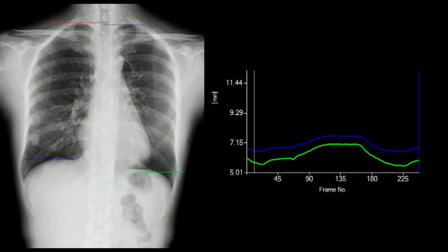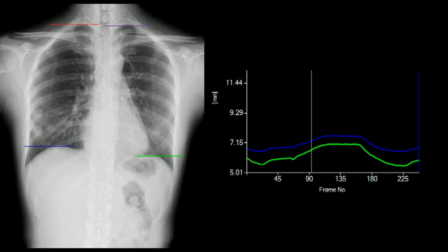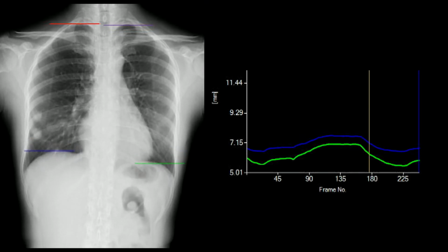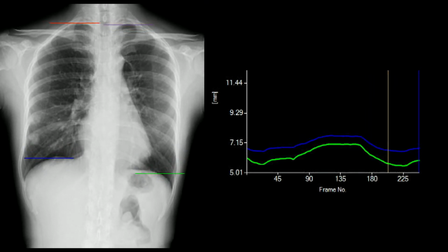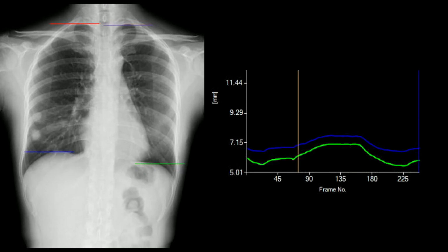So here is just a diagram to show those capabilities. All right. So here we go. This is an example of a dynamic digital radiograph. So here on the left side, you can see the normal breathing of a patient, and you're not fluoroing this patient nonstop. You're doing sequential imaging, very well timed. You can see on the right-hand side the graph of their diaphragmatic movement. So the blue line is their right hemidiaphragm, and the green line is their left hemidiaphragm.